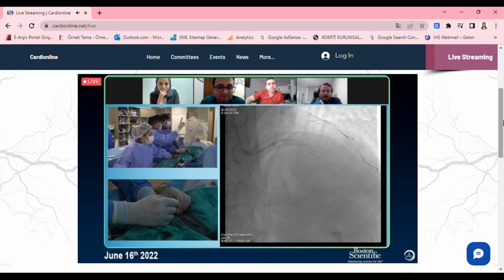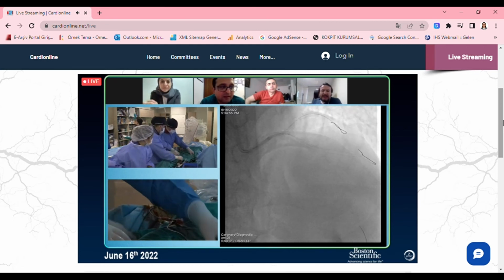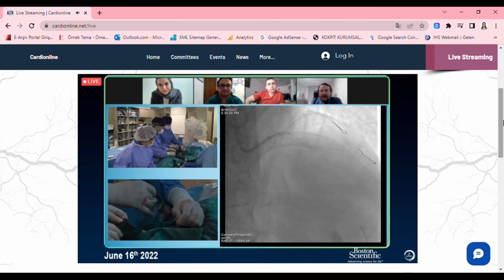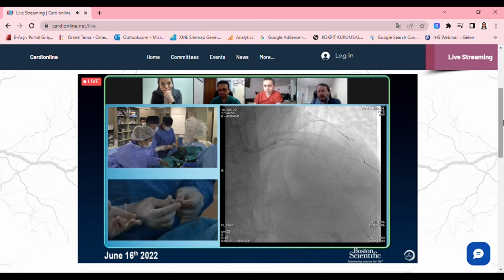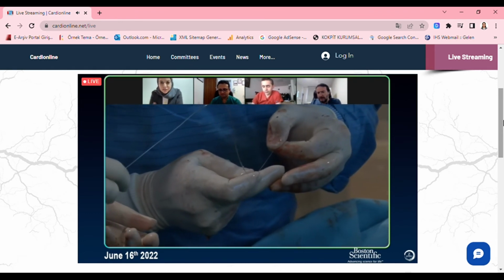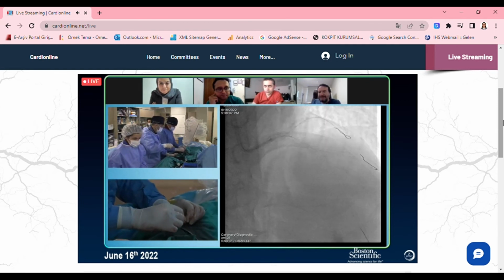Or we can. Omar, would you consider that part again, ballooning with the cutting balloon at that part? We didn't have a cutting balloon at that part. The part where you are now trying to go with your stent has not been ballooned with the cutting balloon. But I think there's a significant dissection too in that proximal. Yeah, of course, there is dissection, but the calcification is also coming in the way, so you cannot push it.